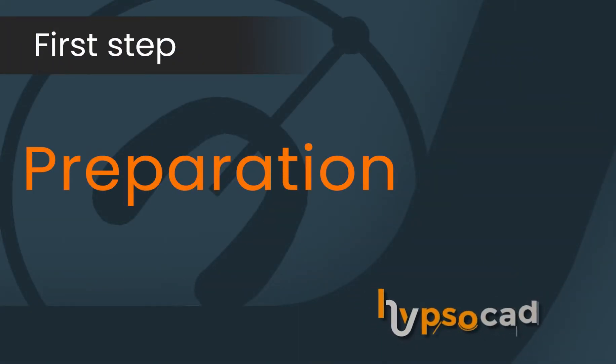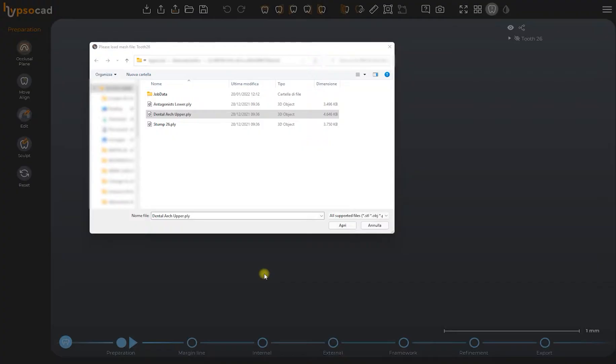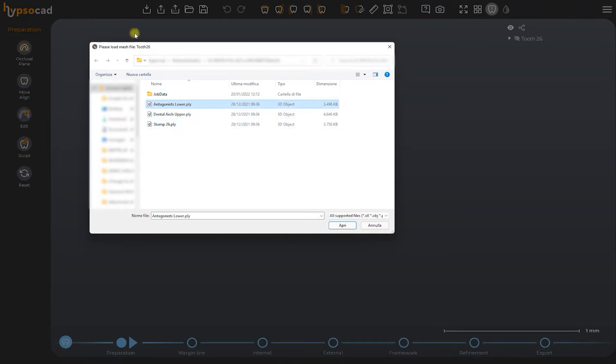Preparation step. After setting the new job, the software will automatically switch to the import of the scanned file.